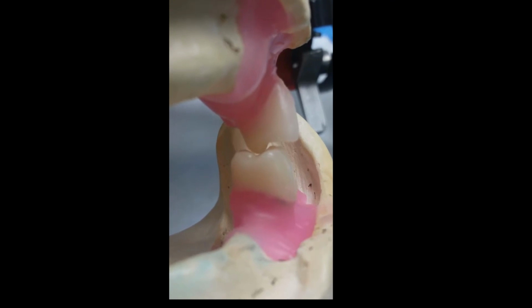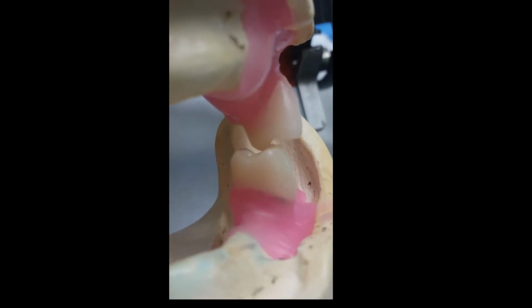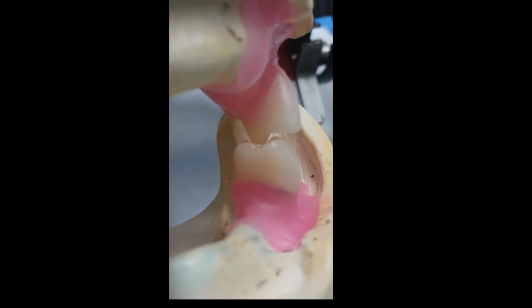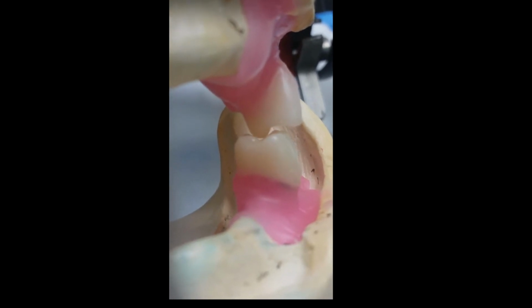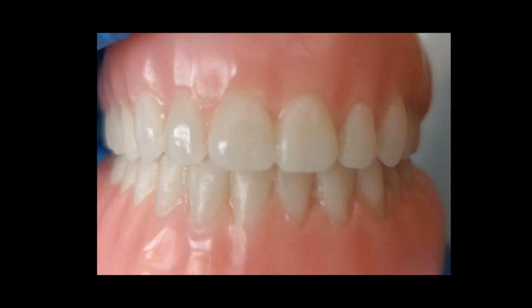So cusp to fossa. We can get denture teeth that have this ability. I have an articulator that can do it, and I use denture teeth that can do it. Again, we have to remember they can't feel their teeth touch. So the idea is that when the cusps come into the fossa, they're able to land in and not hit and slide in.